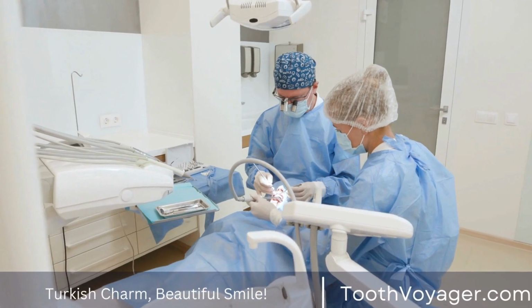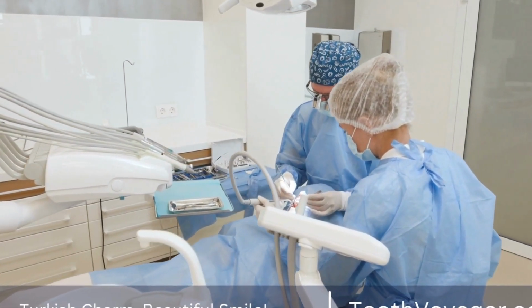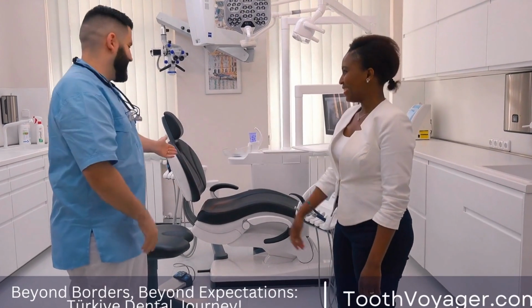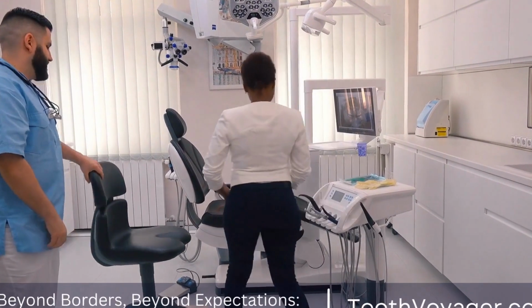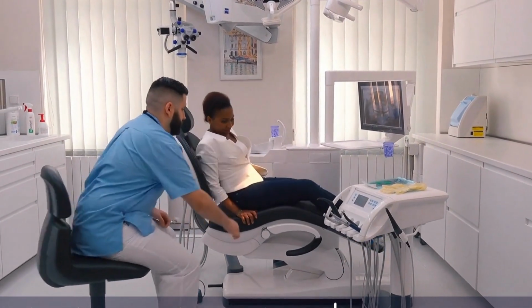Implants for dental implants are inserted in the jawbone and then allowed to heal over about 3 to 6 months. In this period, the bone is gradually able to join the implant via a process known as osseointegration that provides a solid base for the reconstruction.